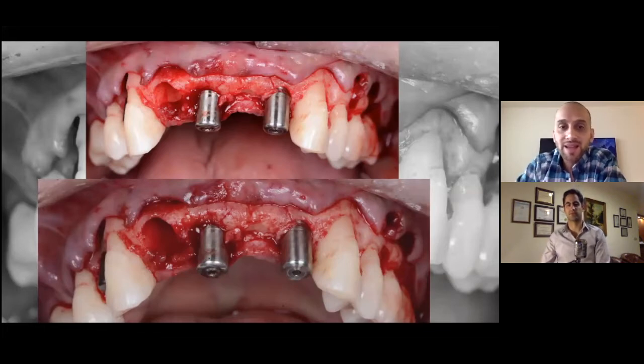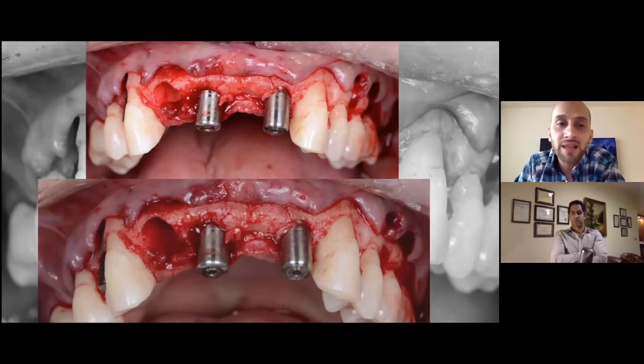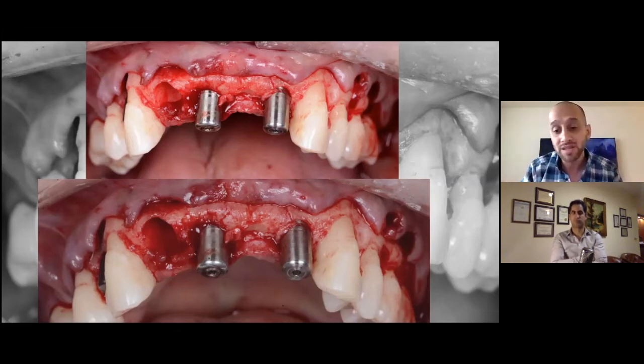Yeah, you can certainly do that, but in this case, I didn't want to run into a situation where I would be placing an immediate implant. I felt like by placing an implant in the healed ridge, I'd be able to have the primary stability that I wanted. So prosthetically, it doesn't matter. However, sometimes I have seen this happen, that you want to place implants in the laterals and the pontics are in the centrals, like you mentioned, you can do that. But what if the canine roots come inwards and you have the chance of hitting the root tip? Because I use long implants for immediate loading, sometimes 15, sometimes you run the danger of hitting the apex of the canine.